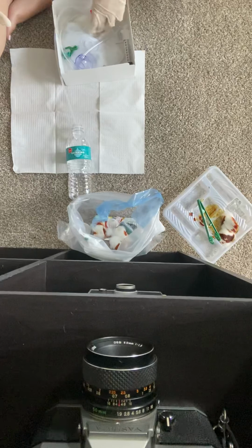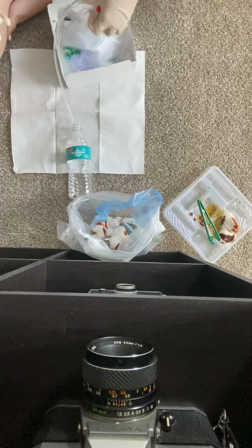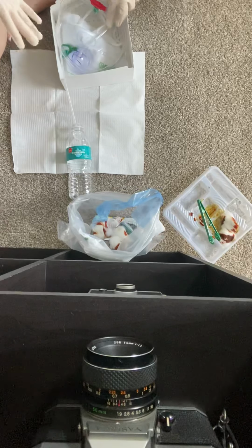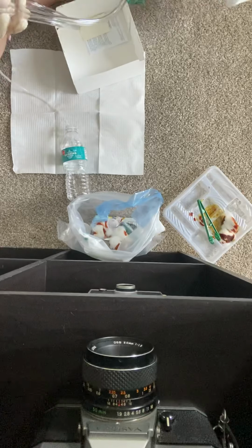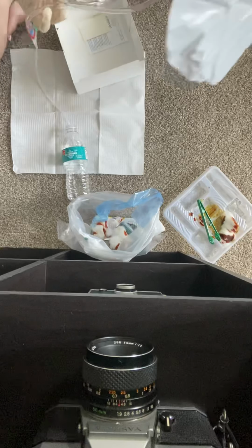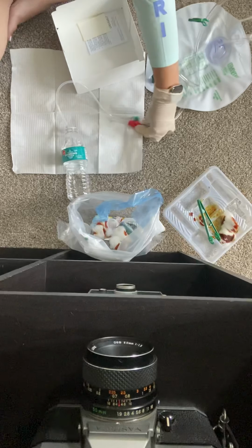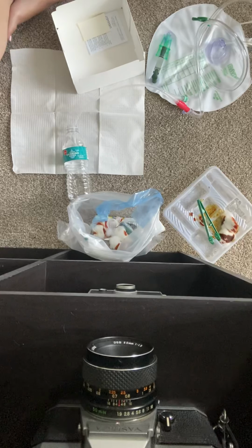Well, I don't think this one has a stat lock in here. If I had a stat lock, I would put my stat lock on now to stabilize it. Then this would be filling up with urine, and I would hang this on my bag. This is where my stat lock would go, and then I would put that on my patient's leg. So I'm going to go ahead and take off my sterile gloves.